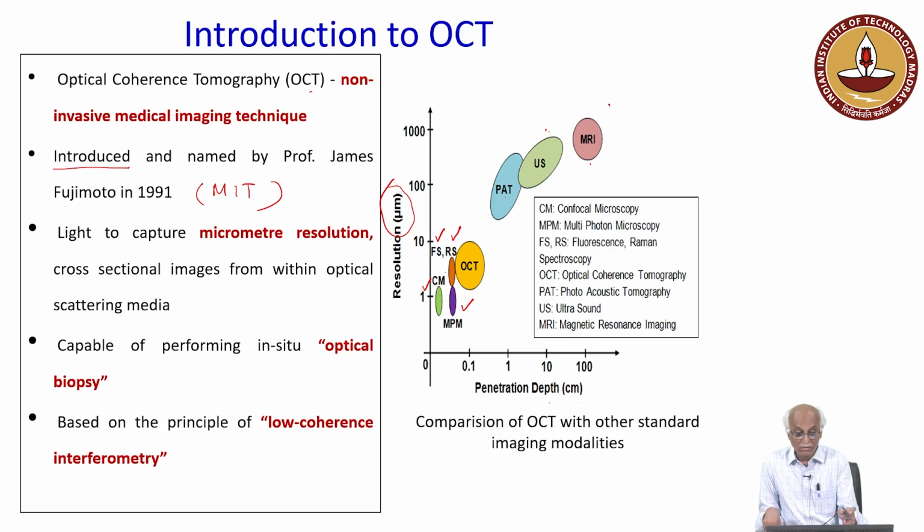This approach has now become very much universal. As an equipment device it started coming in the beginning of the year 2000, and today it is available with most eye specialists, who use this device extensively. So, we will see how it is being used.